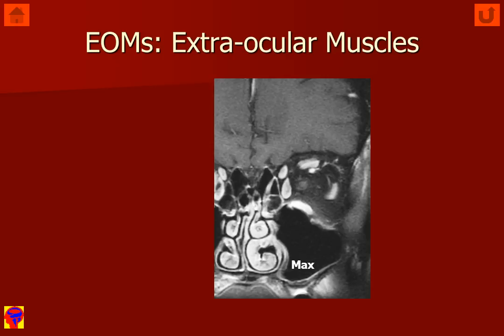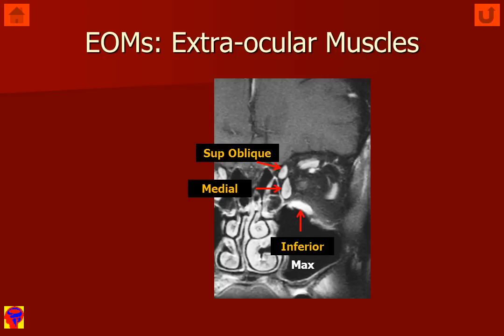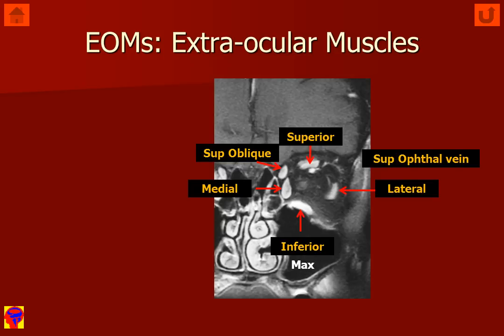If we look at this coronal image, we can see in better detail the extraocular muscles that form the muscle cone. We have the inferior rectus muscle, the medial rectus, the superior oblique, the superior rectus and levator palpebrae muscle. We can see the lateral rectus muscle and we can also see the superior ophthalmic vein.